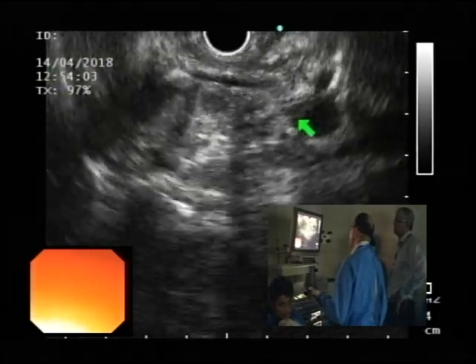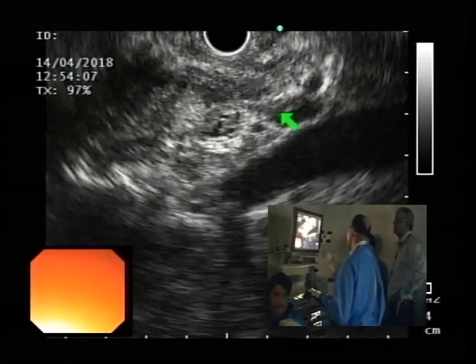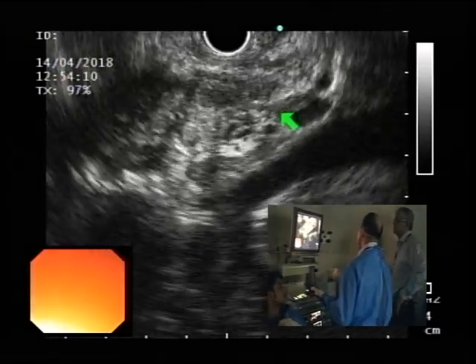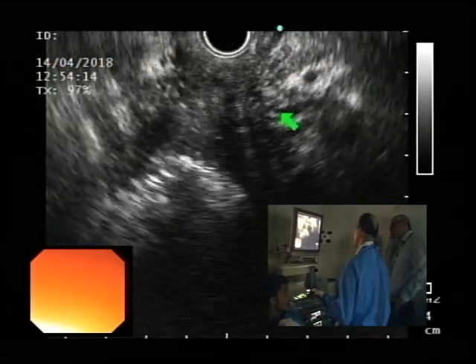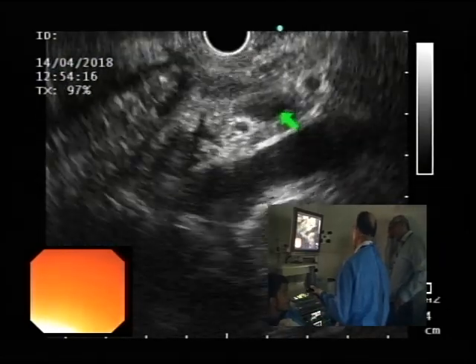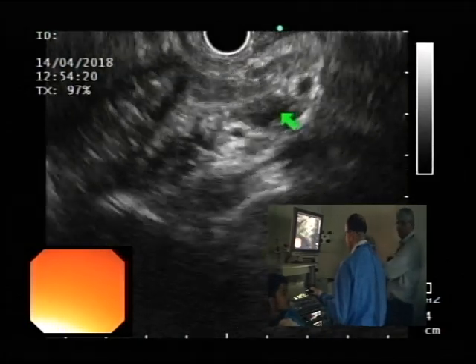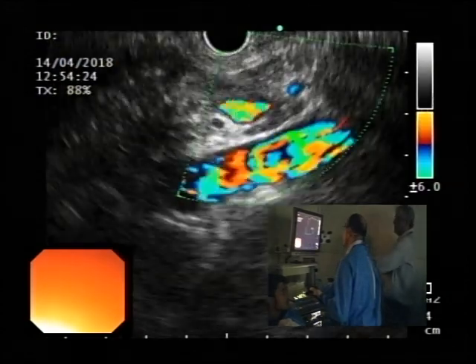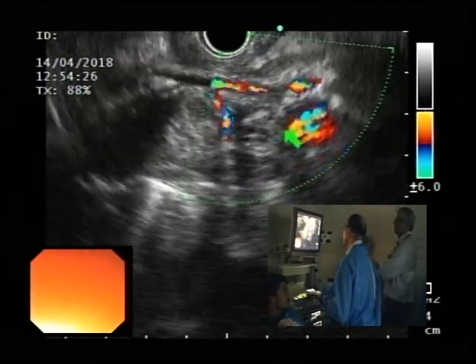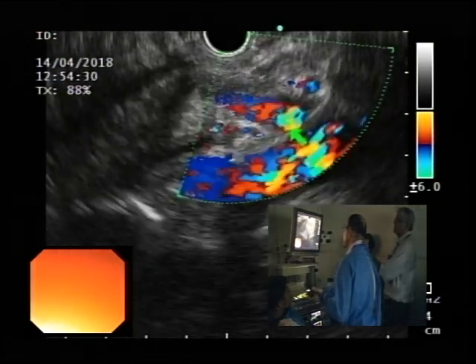But this could easily also be an inflammatory process, primarily because of his age. If this person was 50, you'd be most worried about cancer. What would you suggest? How old is he? 17, 18. I would... Oh, yeah, that's the vessel.